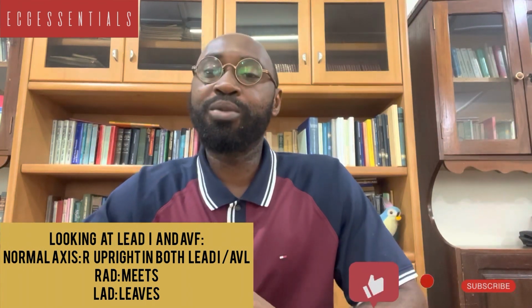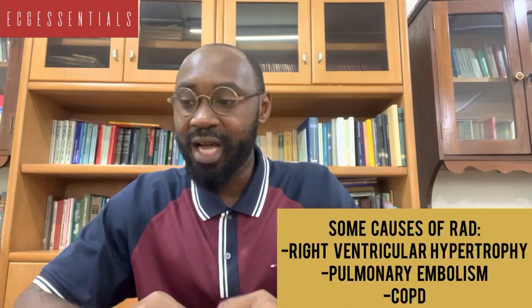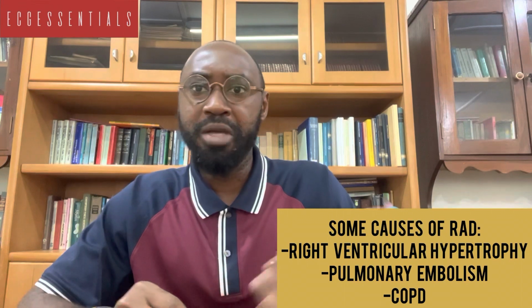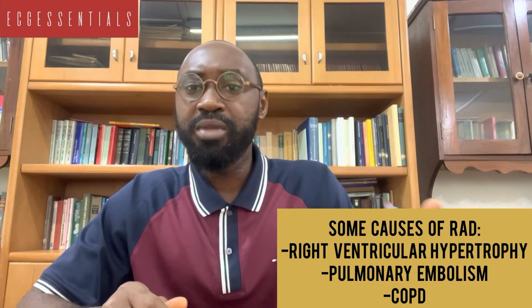But when we actually come to discuss axis in detail, we will even go ahead to try to identify the exact axis of the QRS, not just these mere estimations that we commonly use. So as most of us will be familiar with some causes of right axis deviation, maybe right ventricular hypertrophy, pulmonary embolism, or maybe a chronic lung disease like chronic obstructive pulmonary disease.